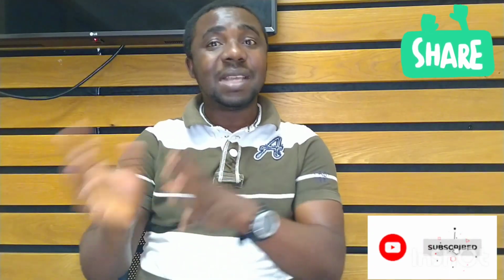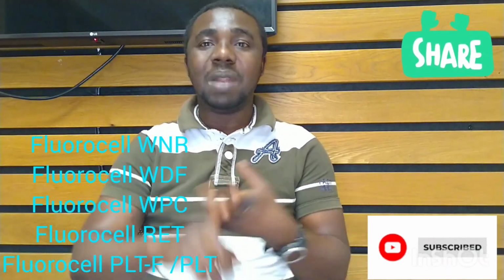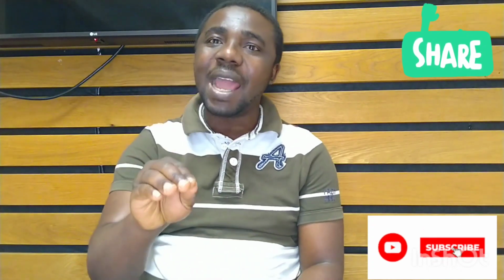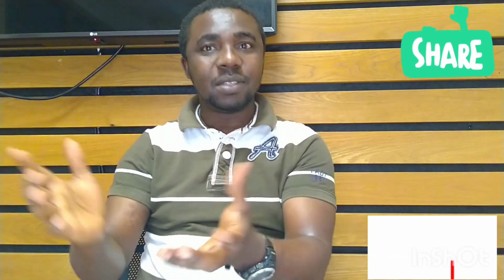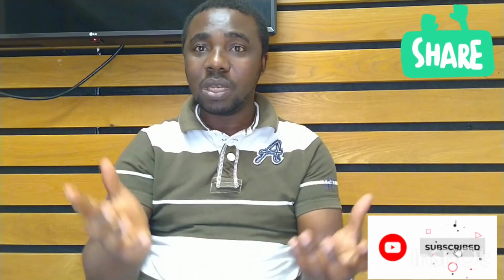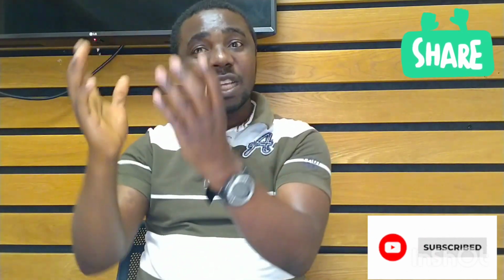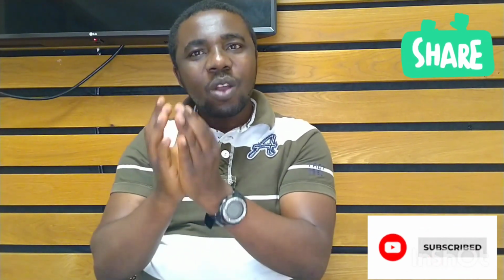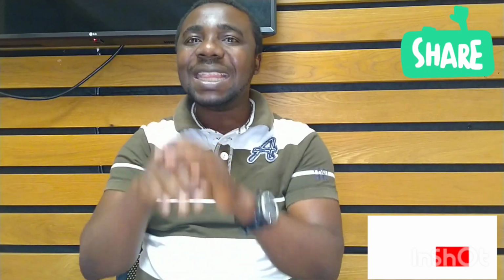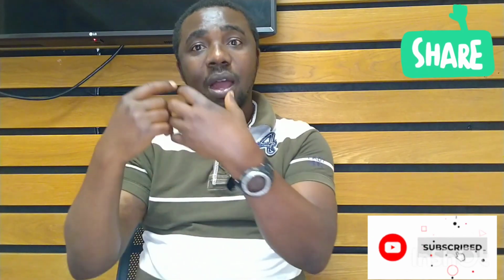Okay, now that you've known about Lysercell, Fluorocell WNR or WDF or Fluorocell Platelet or Platelet-F, whatever, Fluorocell Retic, what they would then be doing is to stain the specific cells, following the lysis, following the exposure of the cells. So once the cells or blood are lysed, they will expose the content of that blood. Following the exposure of the content, each of these fluorescent dyes can then stain specifically, and that helps the analyzer to measure what is there, especially through fluorescent flow cytometry.